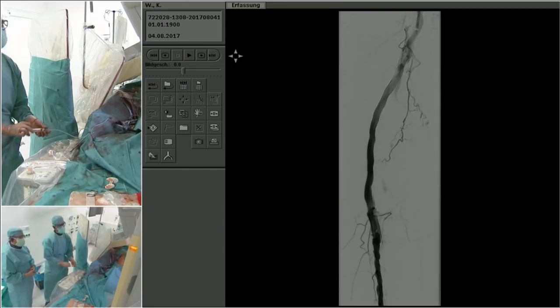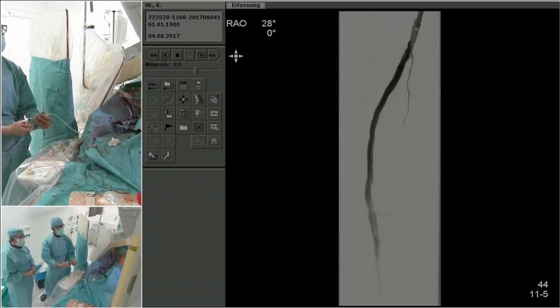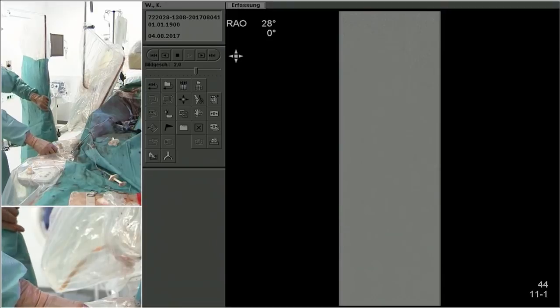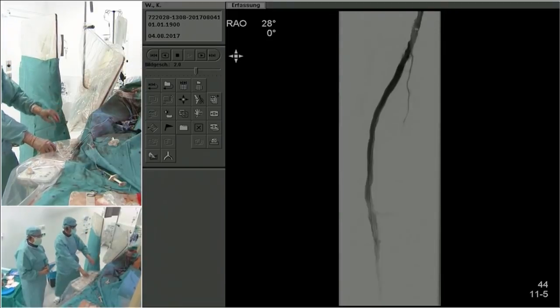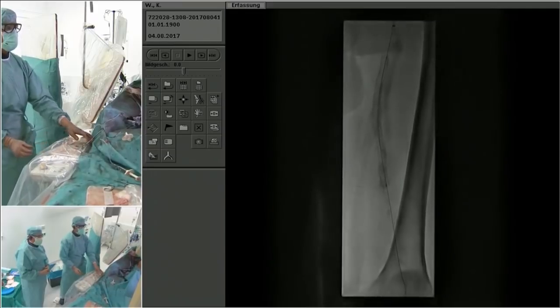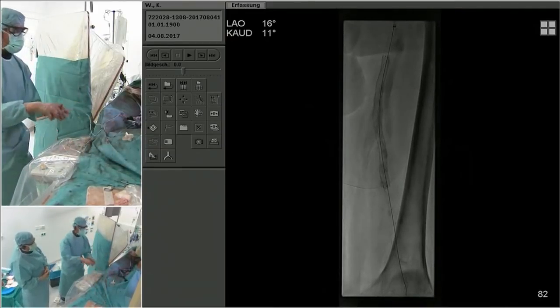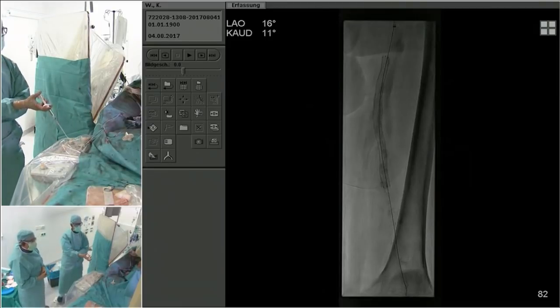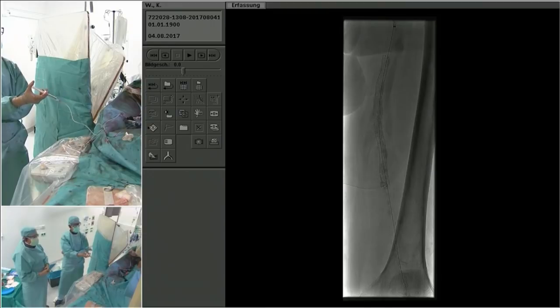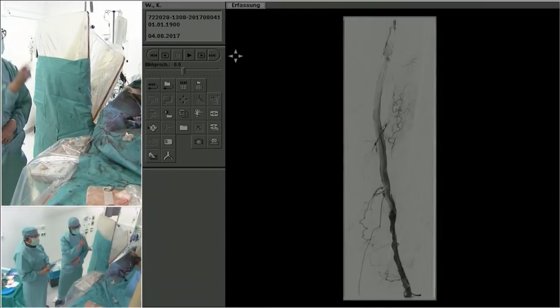Looks actually quite nice. Andrej, what do you think just distal to the Supera, to the Viabahn implantation? Are you completely happy and satisfied with that area? I think, what I see here now, of course it's not perfect, but I'm happy that I didn't take the Viabahn across that area. And I think if we take a drug-coated balloon in, 640 maybe Stellarex, that could be enough.